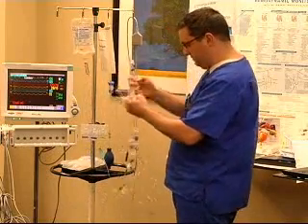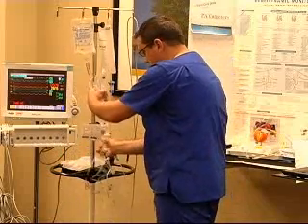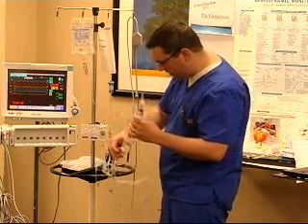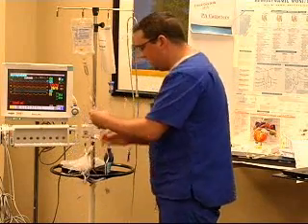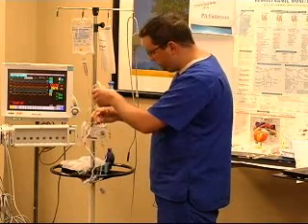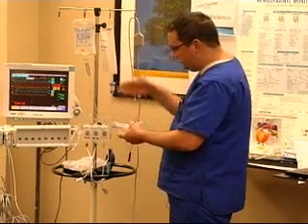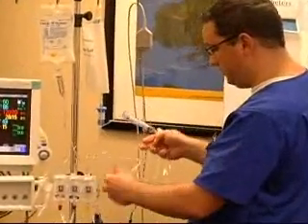I'm going to take this off, clip these in real quick, and the order of this. Some of these cards are already set up. The most important thing about it is that you're connecting the correct cabling to the monitor and to the patient, and it's consistent all the way through. If you want to switch around which one to wear, most of the time just keep the labels consistent. It's usually arterial, CVP, and PA, depending on what your preference is.